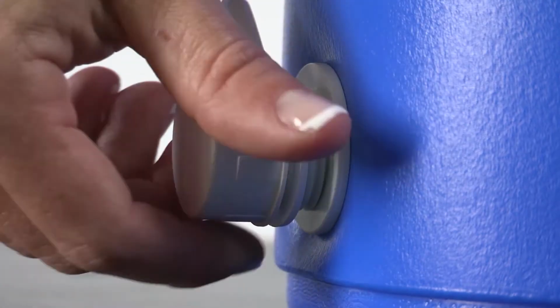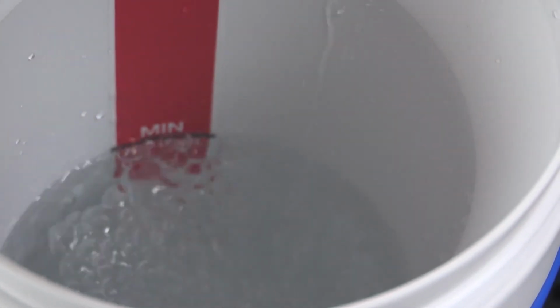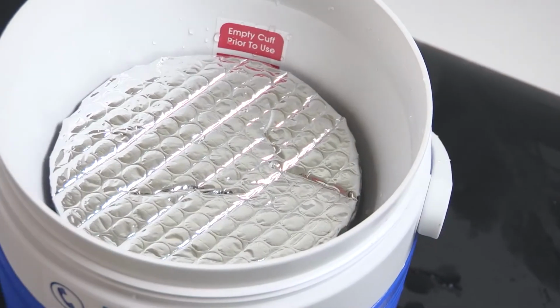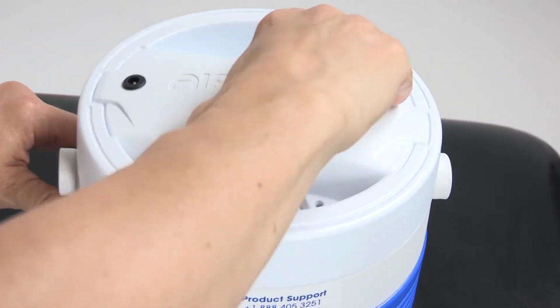Getting started. Prep the cooler before applying the cuff. 1. Attach the blue hose to the cooler. 2. Fill the cooler with water to the line located inside the cooler. 3. Then fill with ice. 4. Apply the insulation disc on top. 5. Securely attach the lid. The lid should be snug.